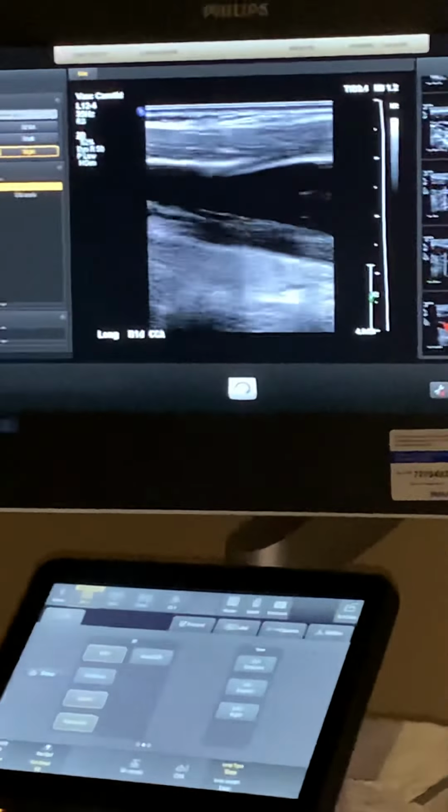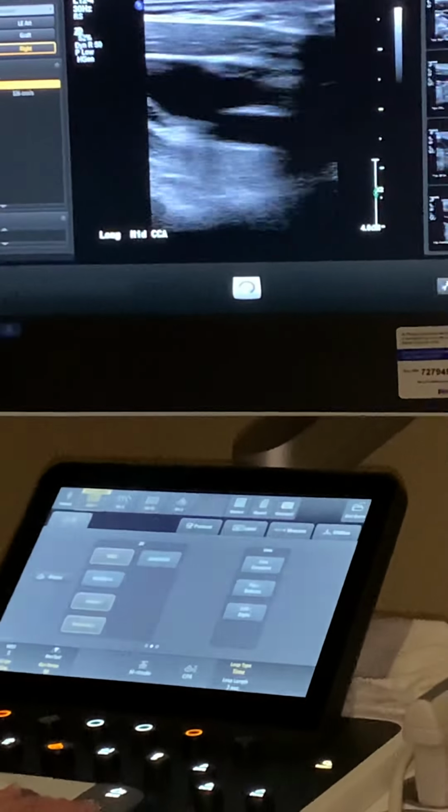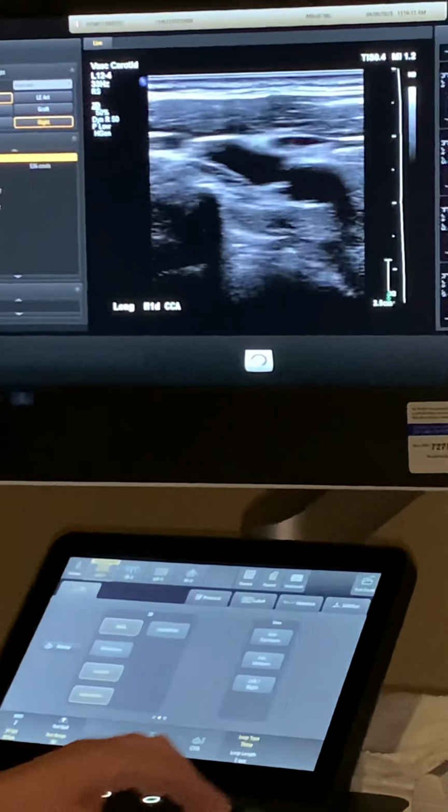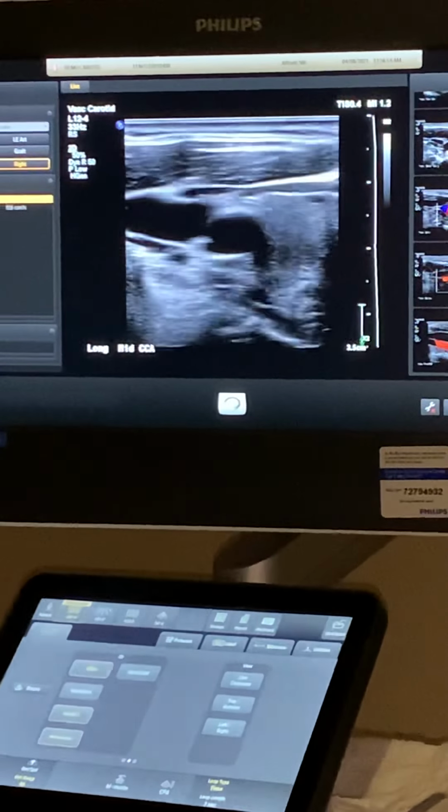Now we just repeat that all the way through. If you need to go back into trans, orient yourself in the midsection of that vessel, that's fine. So we'll go back up here. I can see lobes, so I know I'm mid.